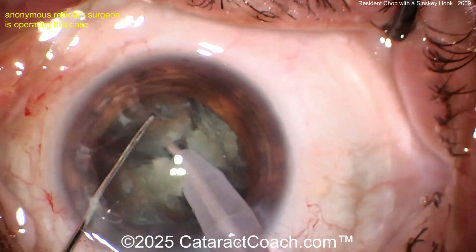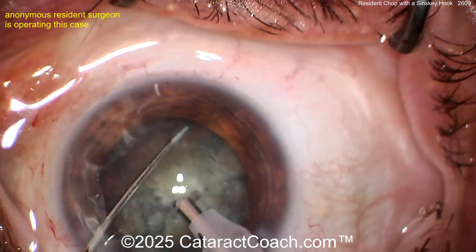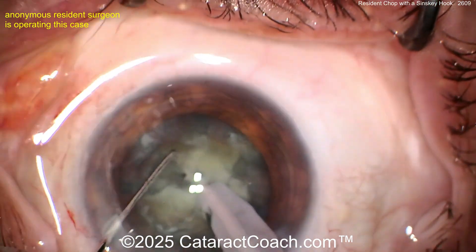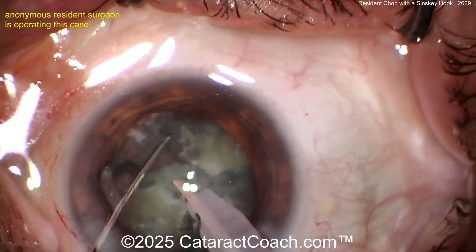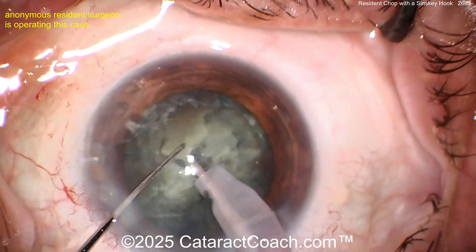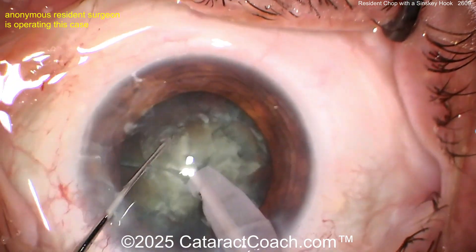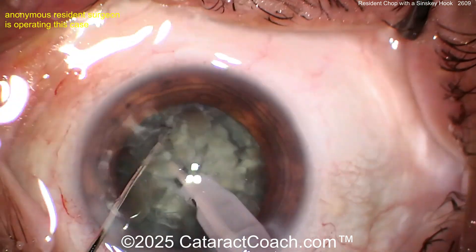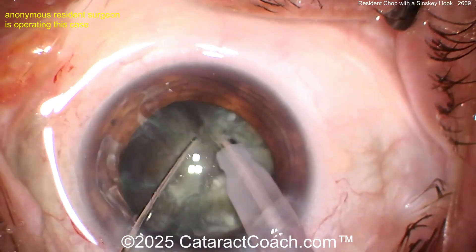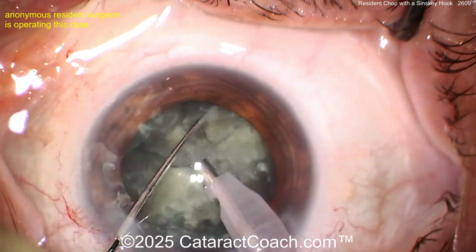Clearly good technique here. You don't need a fancy instrument. Don't email me asking which chopper to use — it doesn't matter. Give me any chopper and I'll do beautiful surgery. By the way, if you want to use my chopper, I have no royalties or financial interest in it — it's on the cataractcoach.com website. Click on 'About Dr. Devgan' and you can find the link to all my instruments.